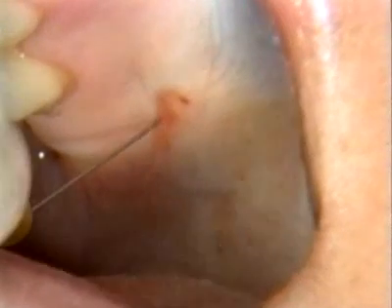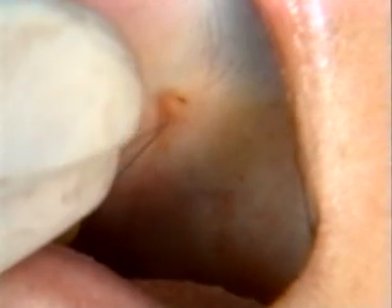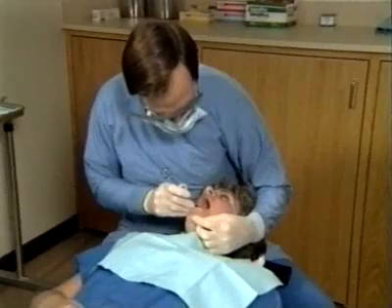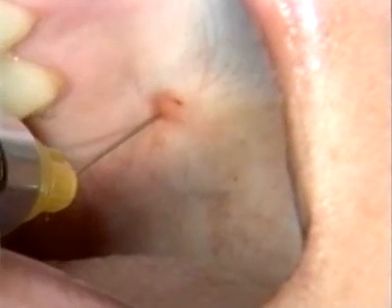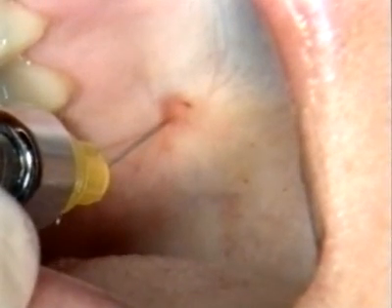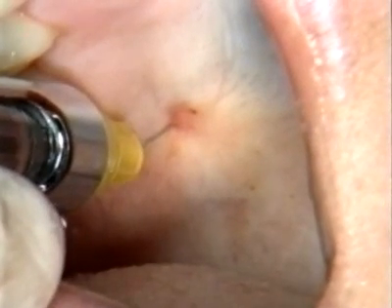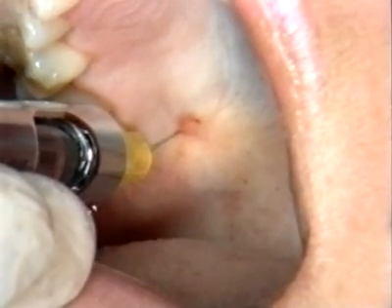After waiting 2 or 3 minutes, the needle is advanced slowly through the greater palatine foramen and up the pterygopalatine canal. A pen grasp of the syringe facilitates the gentle probing that may be necessary to navigate the canal. The needle is never forced. If resistance is felt, the needle should be withdrawn slightly and advanced at a different angle. Following needle insertion to the proper depth and negative aspiration, a full cartridge of anesthetic solution is slowly administered.